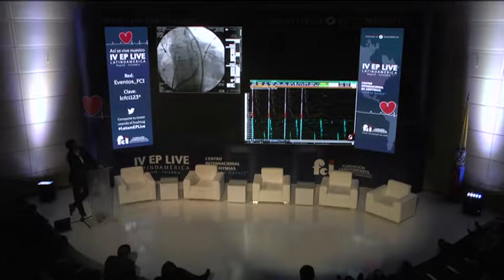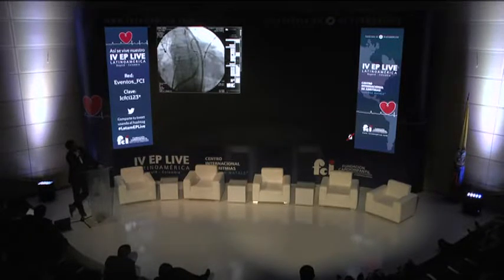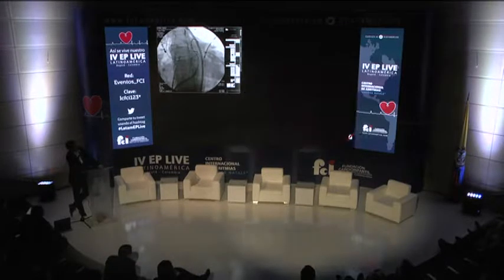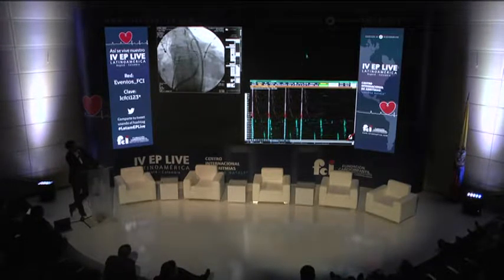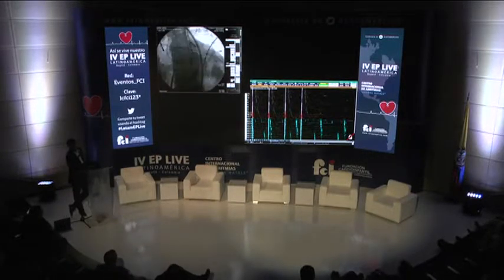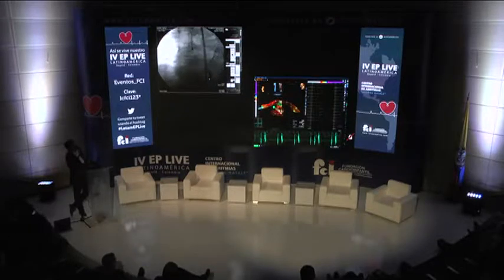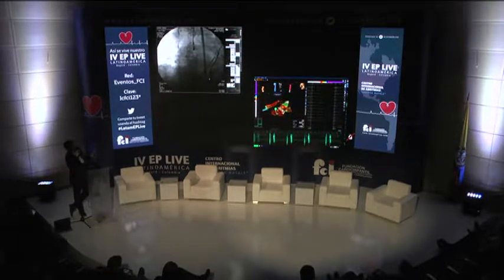Show me in NAVEX the right atrium and the wire. Do you see the wire? Well, it's a wonderful place. It's a magnificent place. We need 3D. Could you please show us on the screen the 3D image? Yeah, rotate it a bit. Anterior oblique, rotate it downwards.